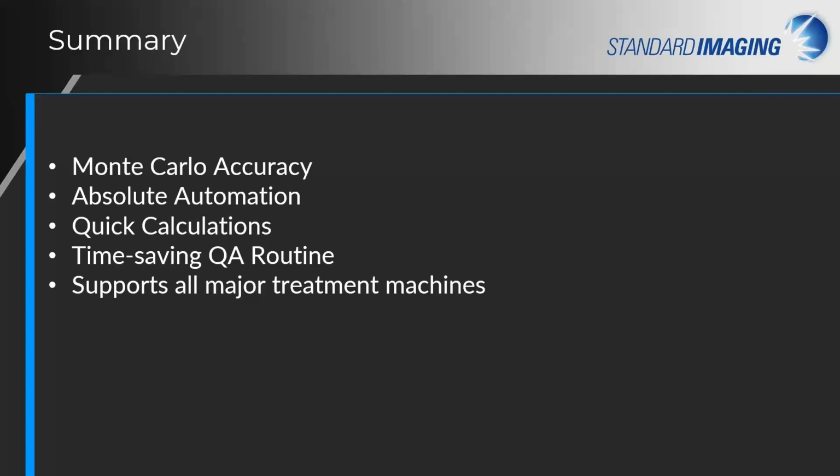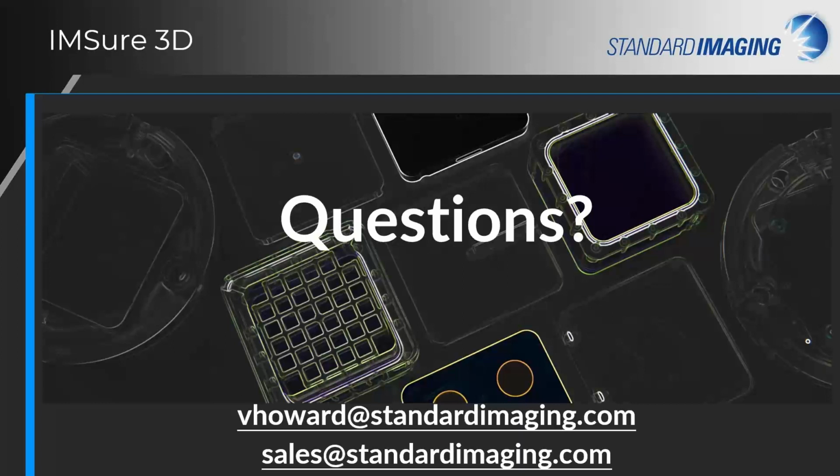So if you're a multi-facility center, which many are now, you can keep track of quality assurance that's happening at other centers, even if you're not on site. Again, IMSure 3D and SIMOCA supports all major treatment machines and techniques.